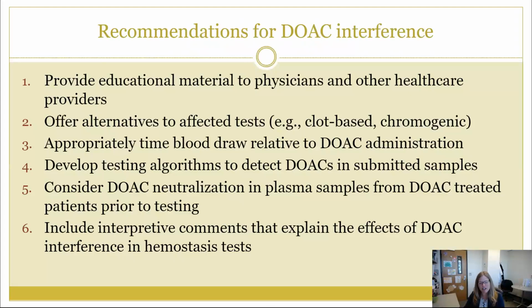My recommendation for dealing with DOAC interference, to close out this section, is to provide educational materials to physicians and other healthcare providers. This is kind of a constant battle. You need to have multiple modes of education. It needs to be ongoing, because especially if you're at a teaching hospital, there will be rotation of your medical students and residents, and you can never have too much education. There are other things you need to do as well, though.